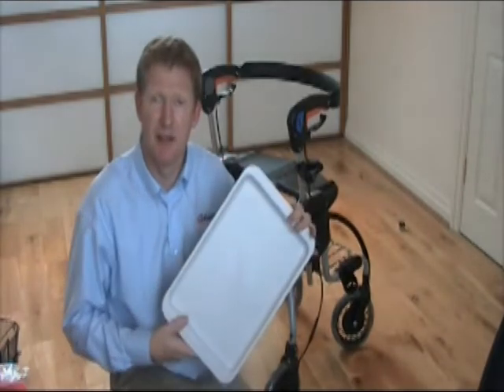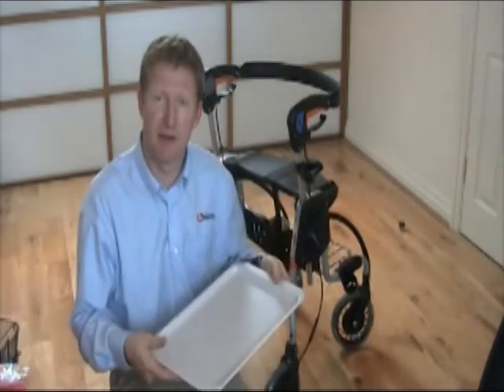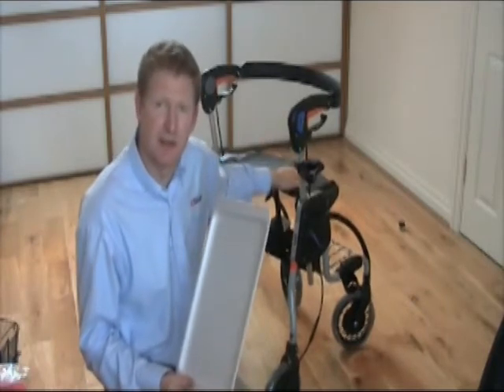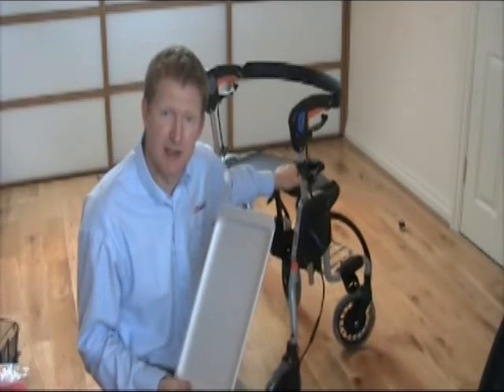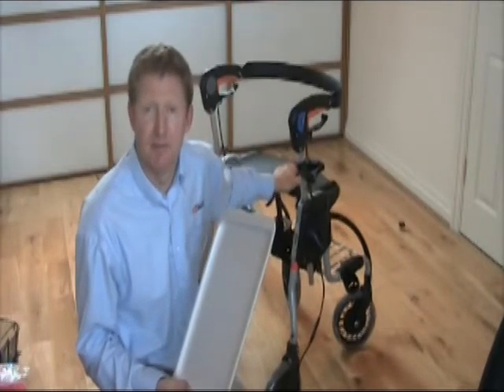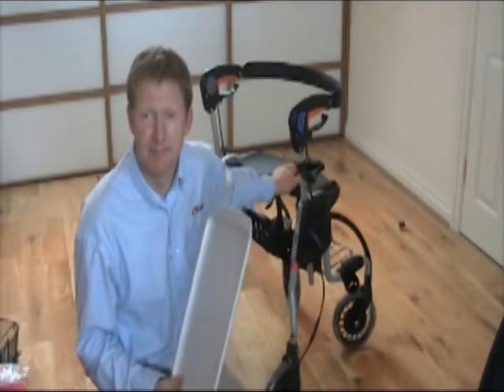This movie is just to give you a brief introduction to the meal tray. This meal tray will fit all the Valeris walkers — it fits on all the seats, which are pretty much the same: the S3, S2, S7, and S7 low. So all models, really.